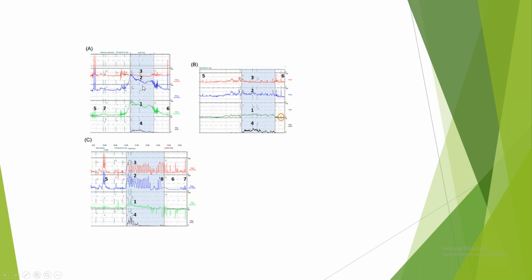Okay, and vesical pressure here is also more, that means she is straining. Sorry, it is not abdominal, it is vesical. So bladder pressure is also more in this case. So this is a case of outlet obstruction. Okay, so how much would be the vesical pressure? Actually vesical pressure is raised, but they have not given any limits for vesical pressure. Only detrusor pressure they have given limits for voiding cystometry. So it should be less than 70 for detrusor pressure.